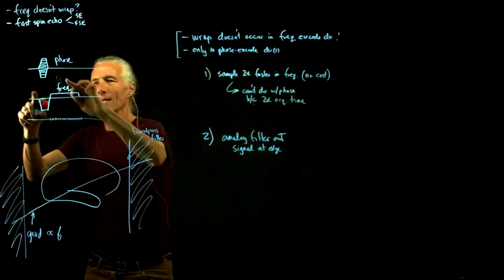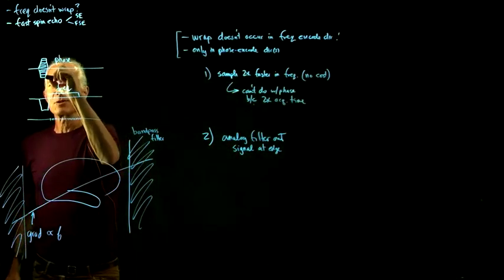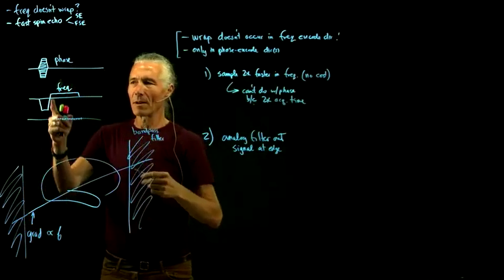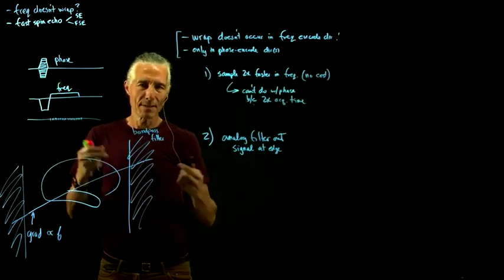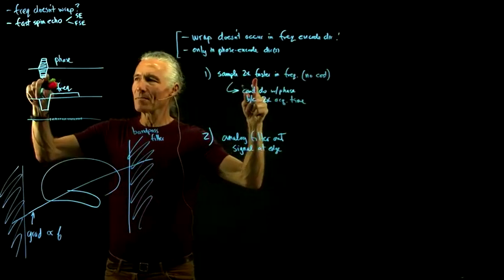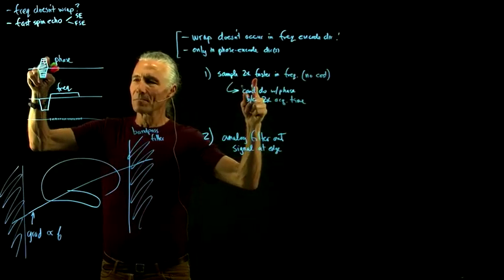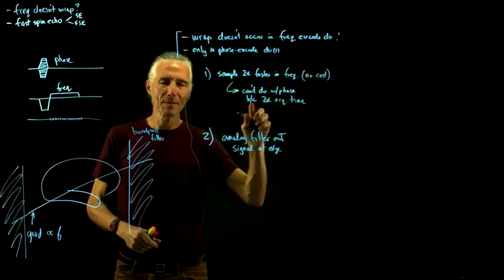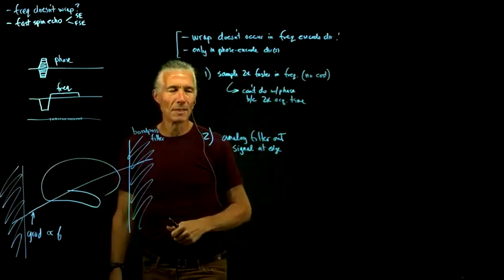So why is that? Because you just turn the phase encode gradient onto a particular setting and then record some data. If you were going to record more phase encode steps, it's just going to take more time. So if we doubled our sampling of the fineness of the different phase encoding steps, we would have to double the time of the scan. So that's not going to work.